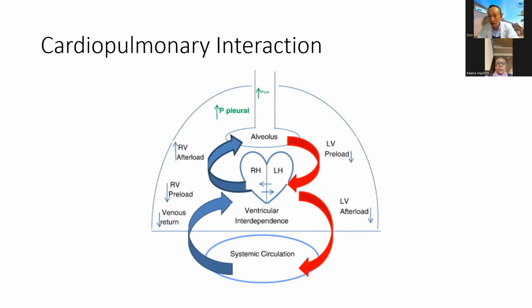Because they really depend on a very fine balance of not having very high pressures in the lungs. If you put the pressures very high, you can really see the neck vessels getting engorged in the head, and prognosis becomes poorer by the day, unless you manage to treat the infective cause and then are able to put less pressure in the lung. Maybe try things like HFOV or something that does not apply too much pressure to the intrathoracic side.